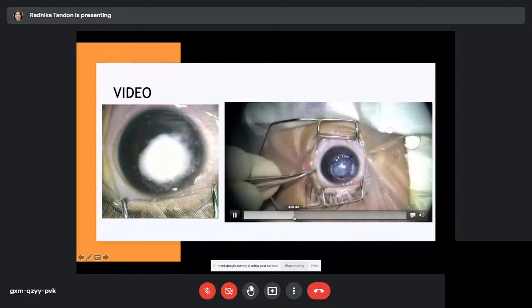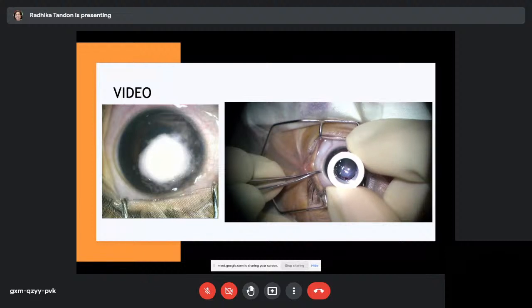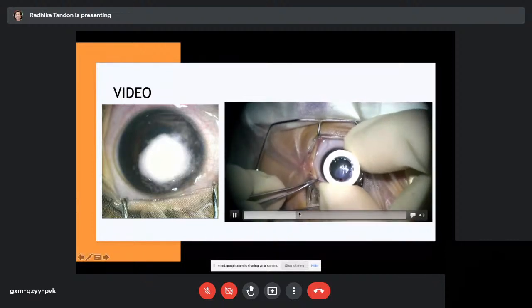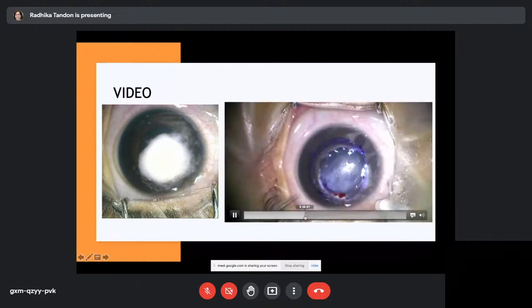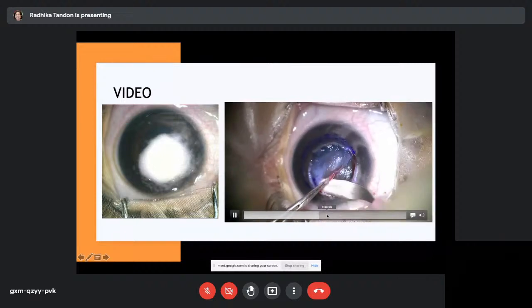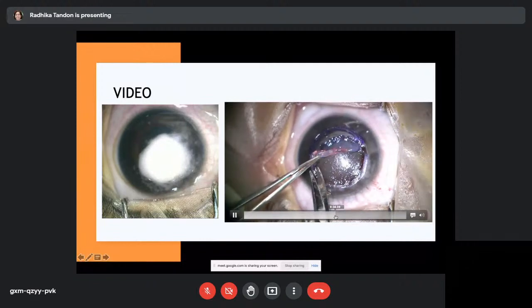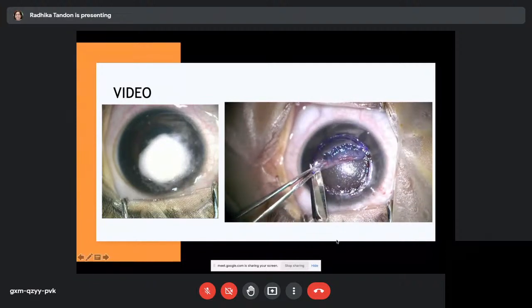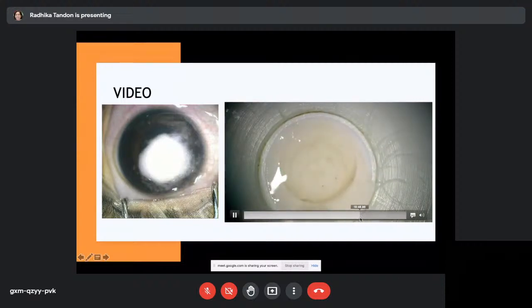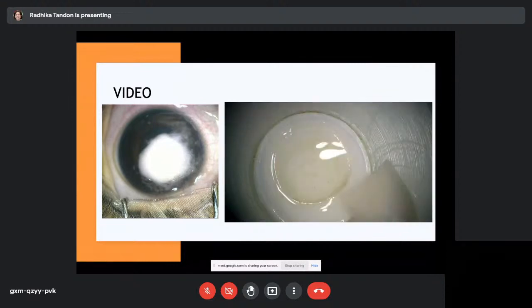The lesion was removed intact. And as you can see, the residual cornea still shows a considerable amount of opacity. And this is in keeping with the appearance that we had first seen surrounding the lesion. You could see that there was an interstitial haze. So then one went manually to a deeper depth, trying to get to a layer where one would feel satisfied that the visual axis would be clear and the patient would have reasonably good vision. And when we reached the appropriate layer, we then went ahead and did the donor cut after measuring the depth that we wanted.